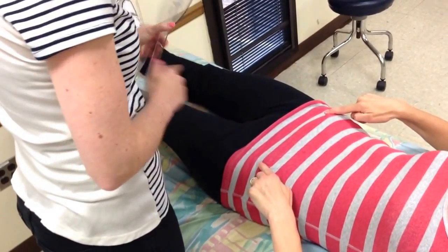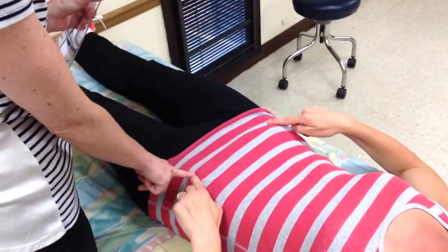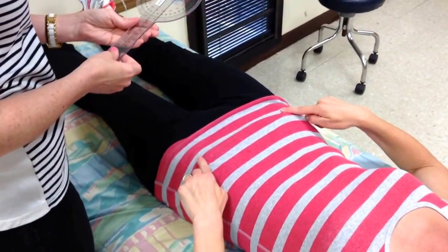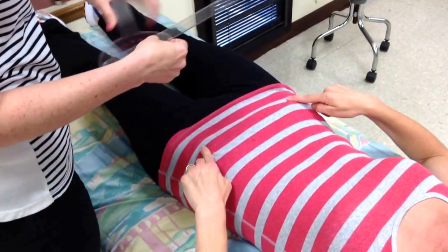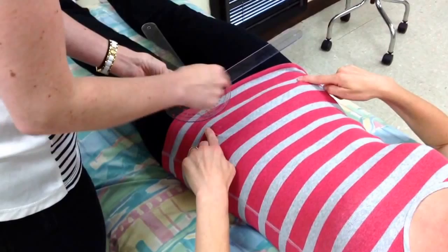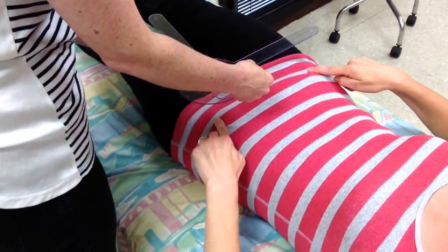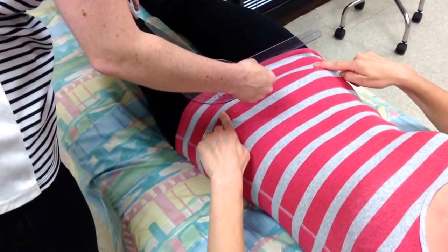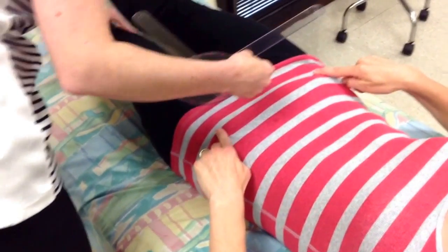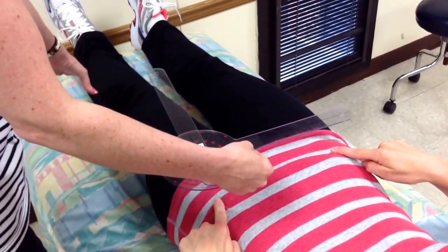The fulcrum goes over the ASIS on the test leg. So if I put the fulcrum over the left ASIS, then I'm testing the motion of the left hip. The stationary arm is going to go across to the contralateral ASIS, and the moving arm is going to line up with the anterior midline of the patella. I want the patient to bring her toes up toward the ceiling and keep her kneecap and toes pointed up — in other words, we don't want the patient to externally rotate.